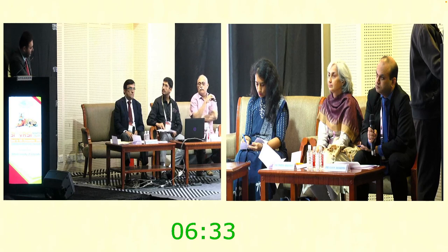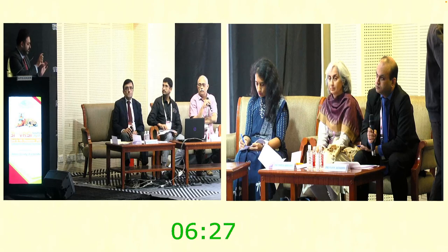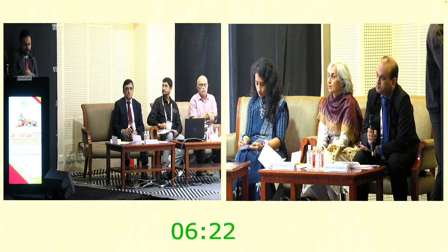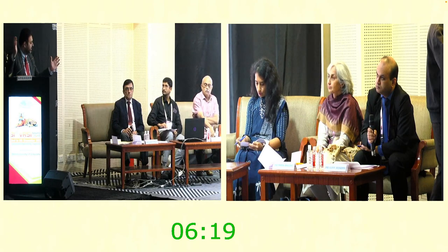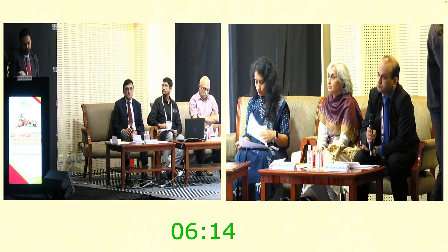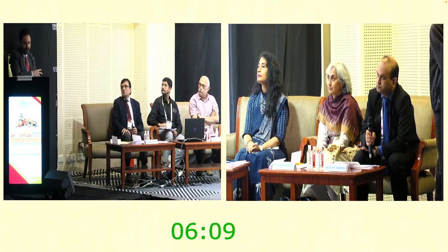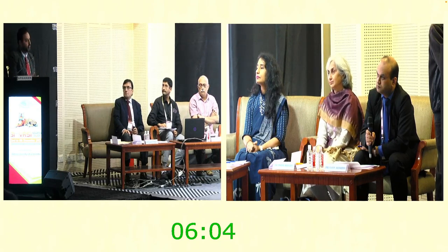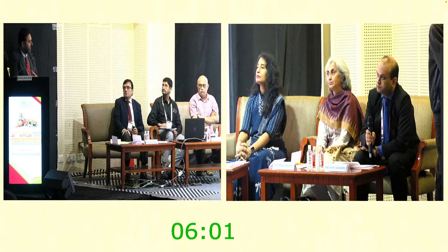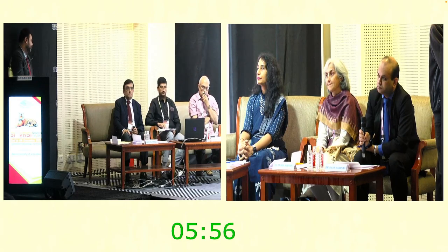However, if we are passively aspirating from the source, and because there is no cutting action, it goes directly into the syringe, gets capped and sent over. That was also shown in the second last slide, in which the yield is more and the cells look exact. I remember the first time I sent this to my colleague, about 3.5-4 years back, my colleague actually called me and said he had not seen such cells even in blood, in people who have lymphoma cells. So the morphology that I got with that, and I haven't had a false negative ever since I've been doing it.